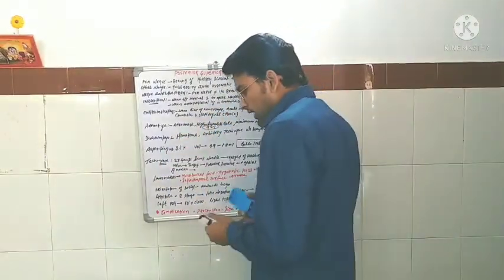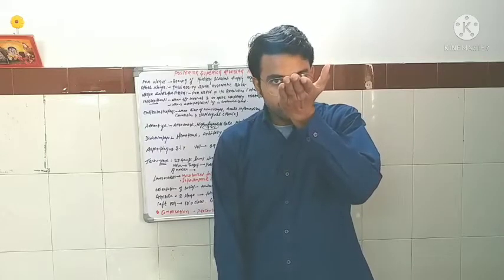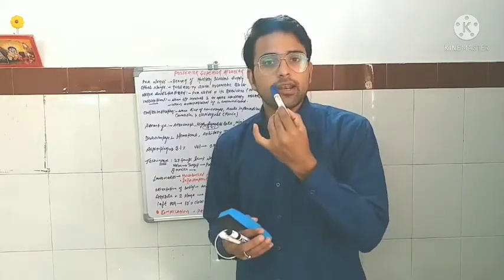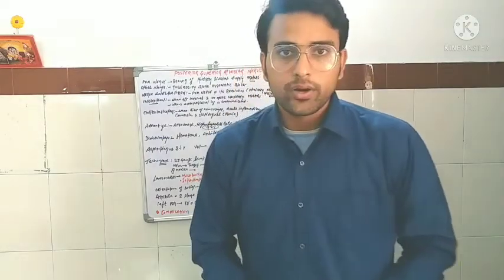Then, after advancing the needle posteriorly upward, backward and inwardly, this will be your needle point of insertion, making a 45 degree angle.